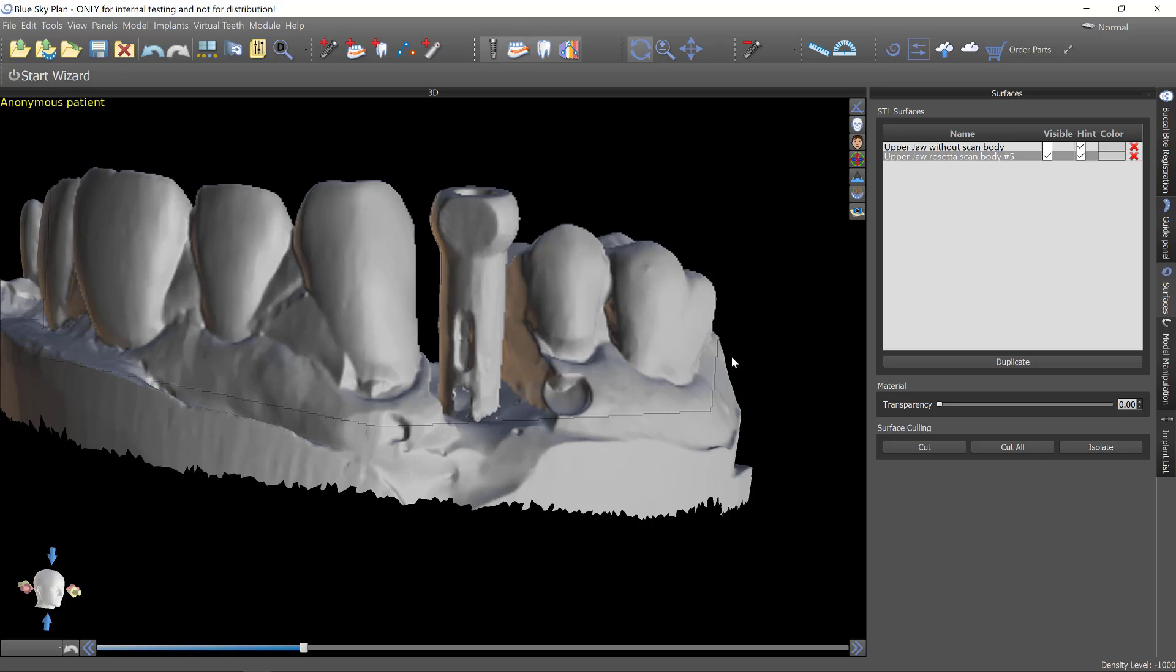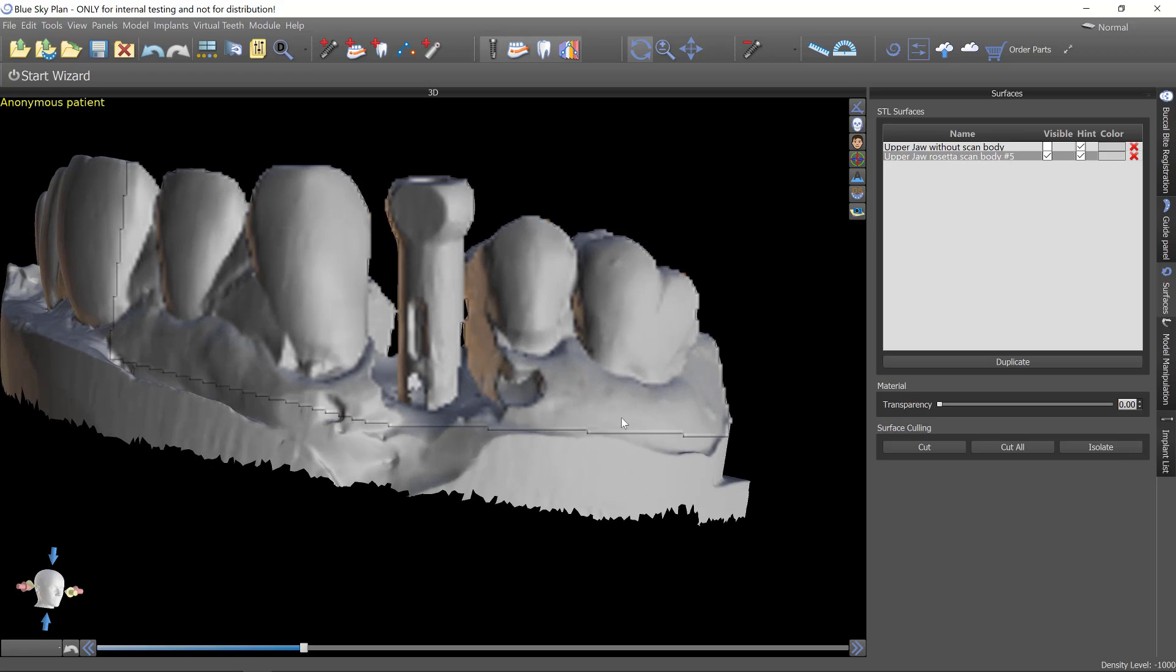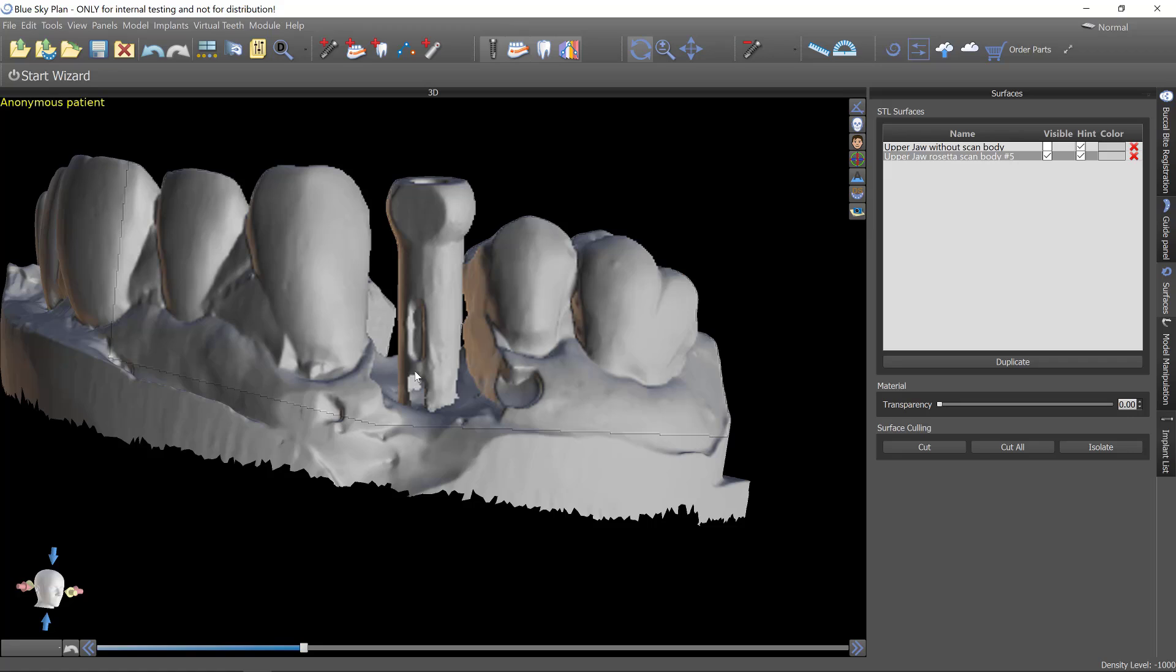What I've done is just imported two models. The first is a model of the scan post. A Blue Sky Bio tie base was used, screwed into the implant with the Rosetta scan post extender placed onto the top of that. Then the ExoCAD slash 3-shape ball was placed on top. So that is the apparatus that you see here for purposes of scanning.